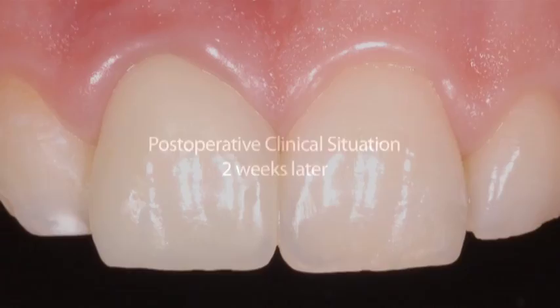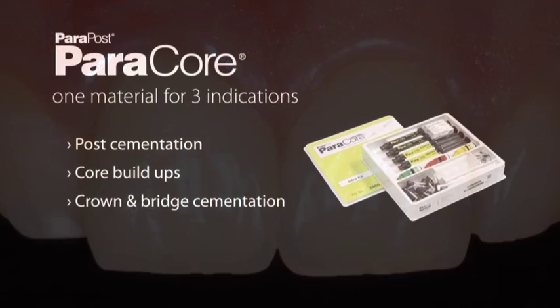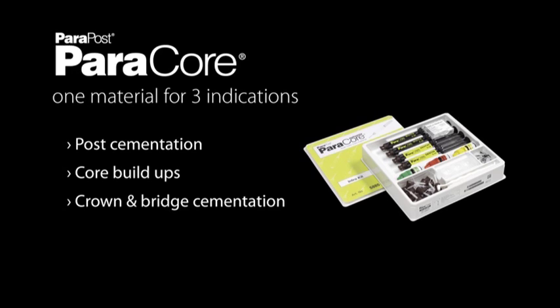Two weeks later, the post-operative clinical situation shows a successful clinical result after the application of a ParaPost glass fiber post, Parabond adhesive and ParaCore for cementation, and the core build-up. This comprehensive aesthetic system is the perfect foundation for a successful and secure post and core restoration.